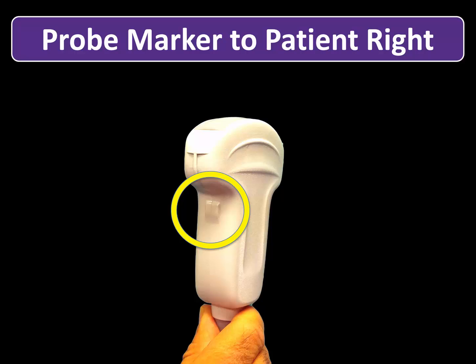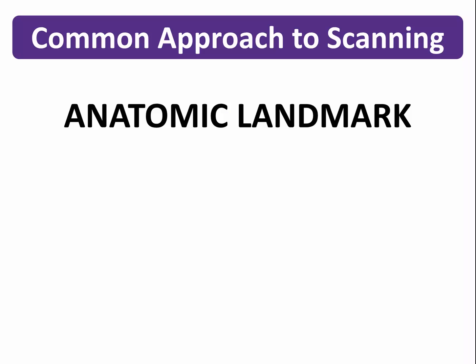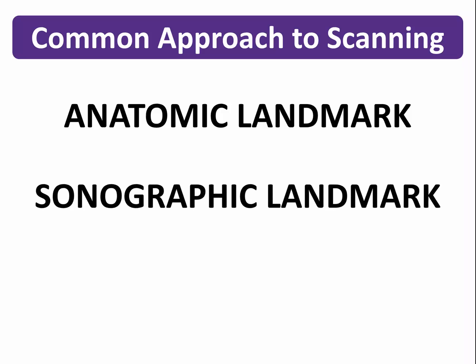Well, how do we begin? In all our tutorials, a recurring theme will be the approach to the basic application. What do we mean by that? Well, for every basic application, we start first by identifying the anatomic landmark. Then we identify the sonographic landmark. And finally, we identify the area of interest.